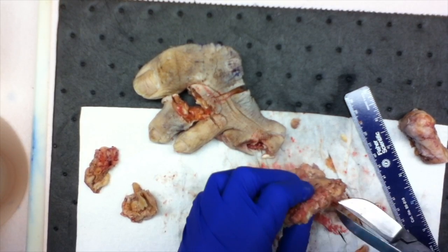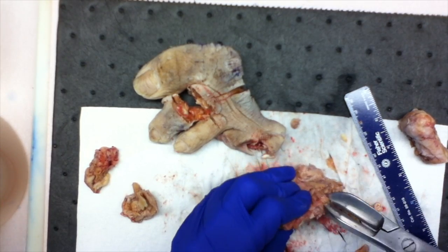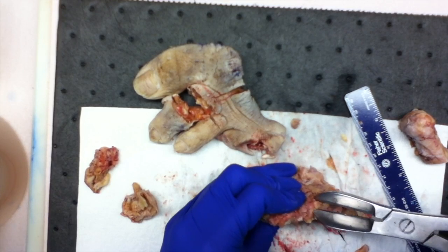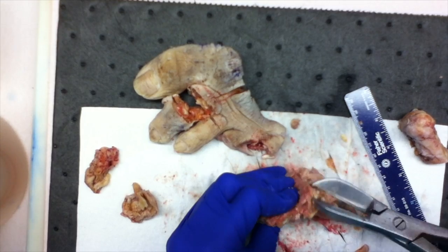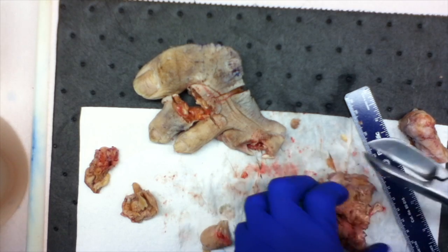Then I'll do my third metatarsal bone margin. Say cut these any way you can.